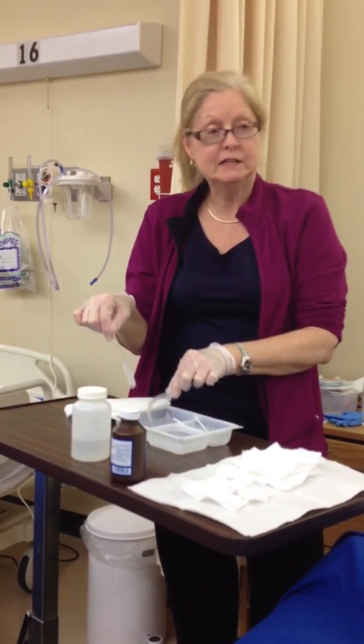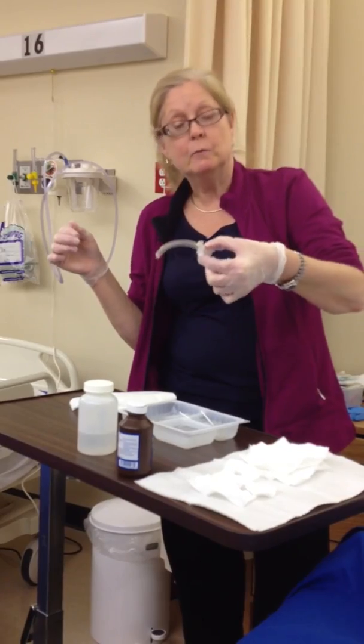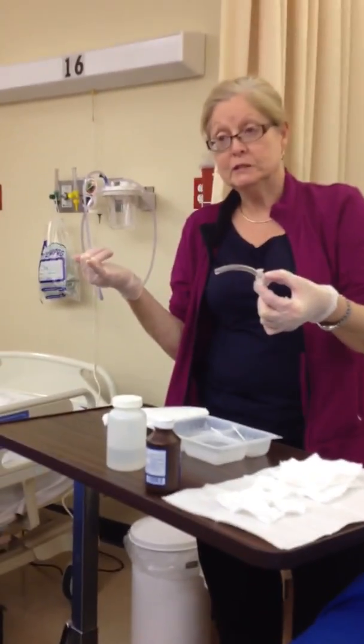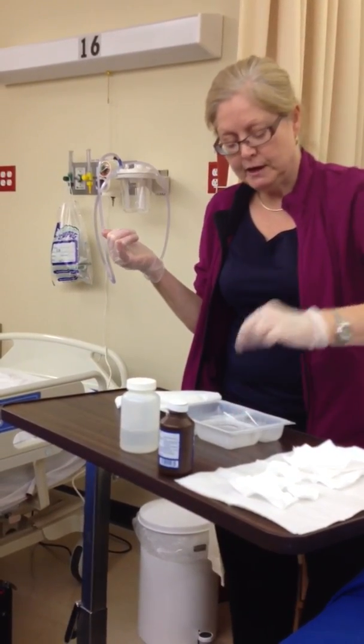Now my brush is done, and do I need to do anything with it? Am I coming back to this part of the tray? No. So I'm just going to drop it right there. And now what do I have to do with this? Rinse it with the normal saline. Plain normal saline. Remember, we are rinsing, and then I'm going to show you how we pat dry here.